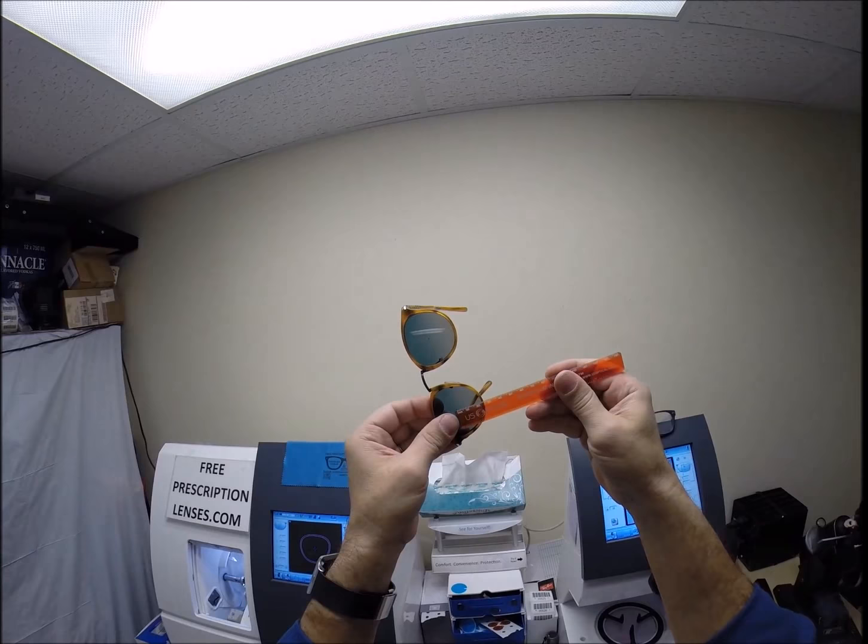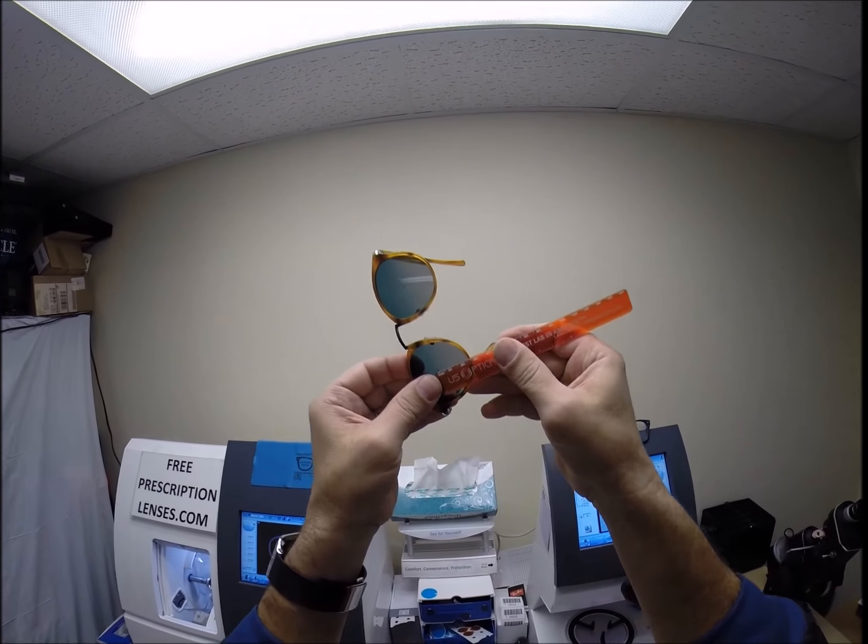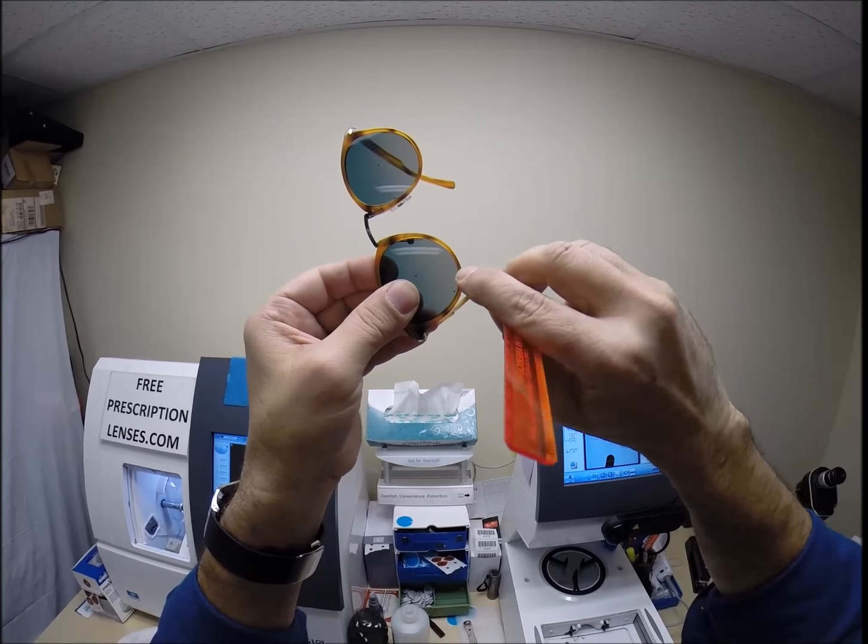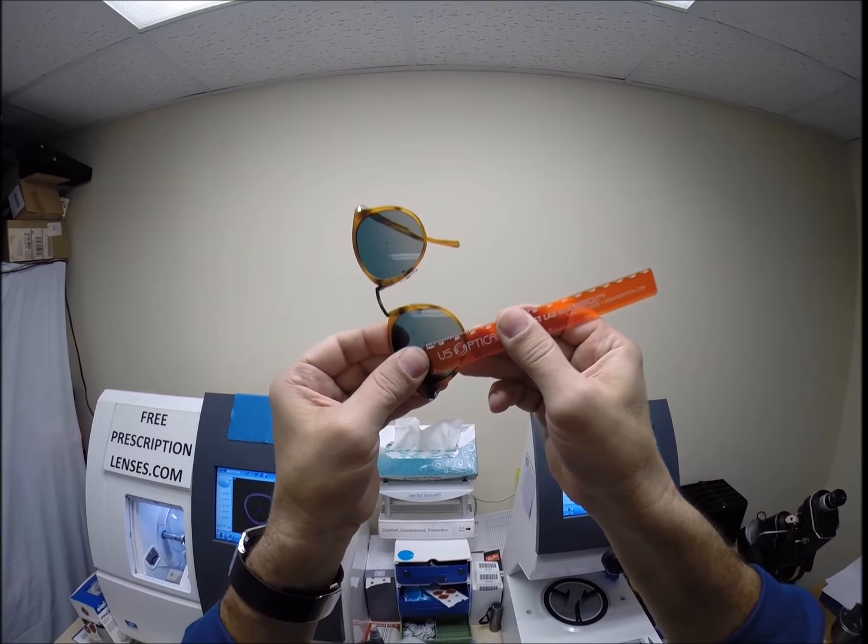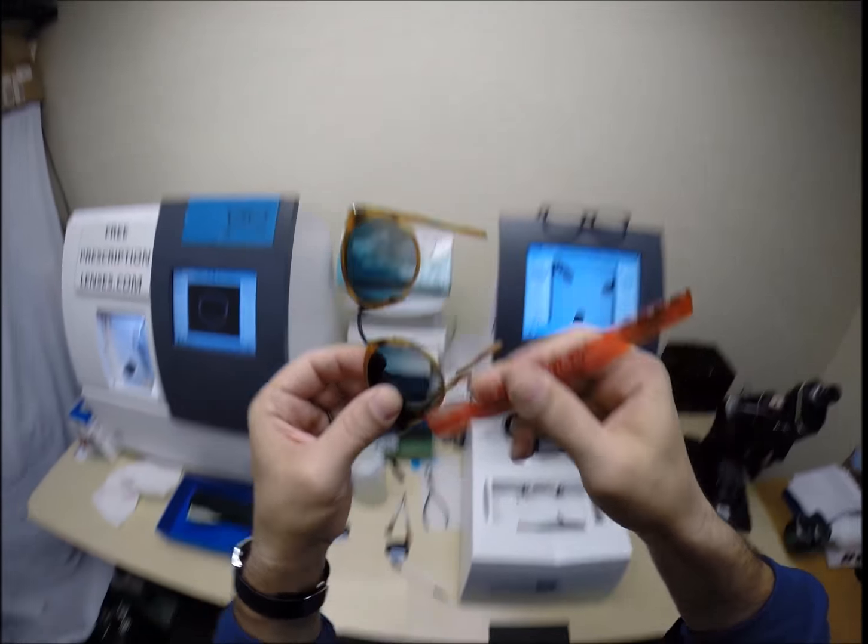I do want to check the optical center height of 24. We're going to the middle of the frame. Not the bottom of the lens, but the middle of the plastic. And we're getting 24. So, that is cut perfectly.